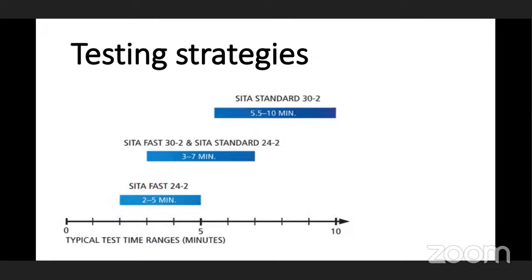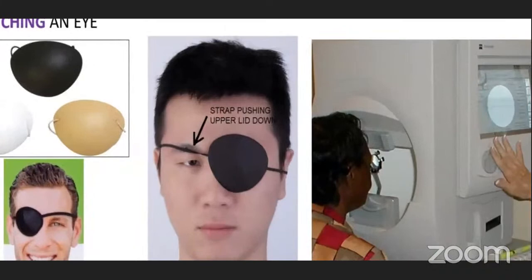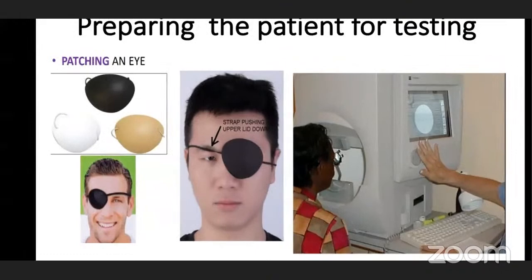Preparing the patient for testing. First, we need to patch the eye. The strap should not be pushing up or down, which would be improper; patching should be done correctly. Next, the patient's chin should be placed on the chin rest and forehead on the head rest properly.